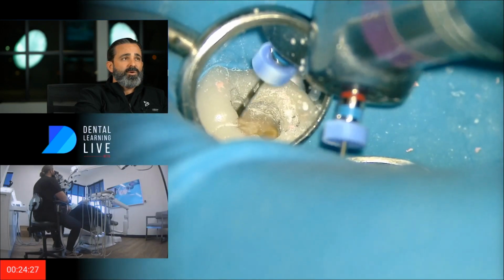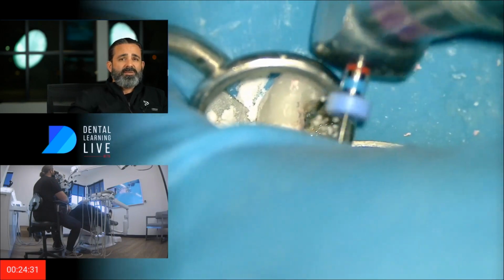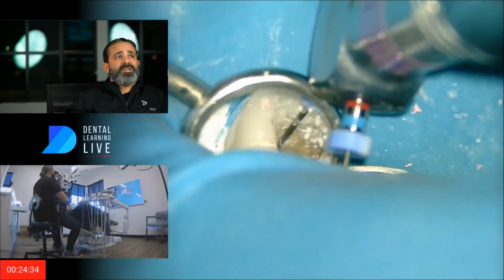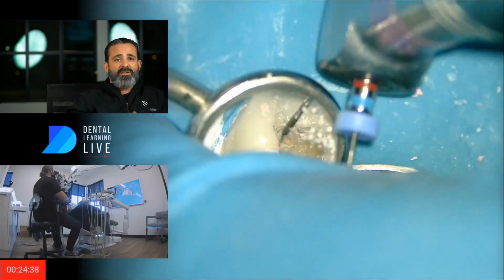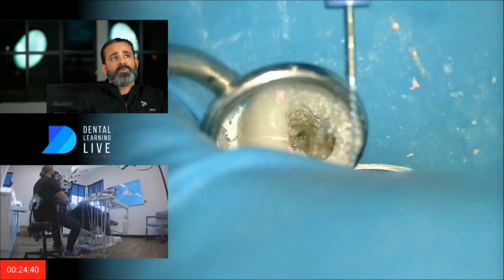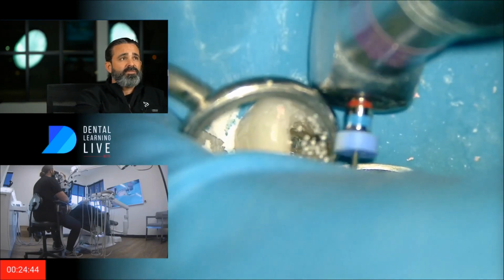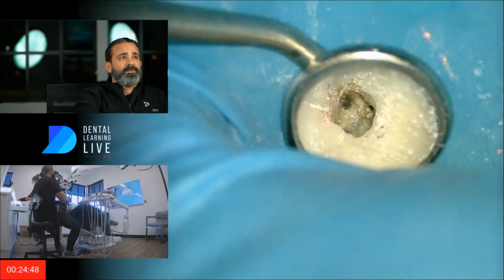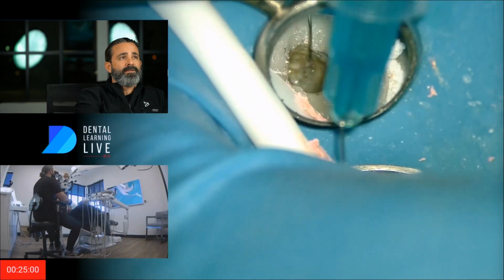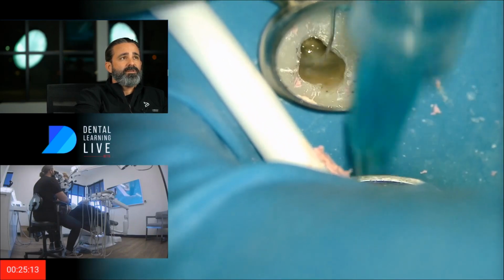And then just going around one final time since I put solvent everywhere, I'm just seeing, sometimes I think I'm clean. And I'll do this technique at the very end with this 3D shaper and more solvent. And sure enough, I'll be pulling up more sealer and I'll be pulling up gutta percha even when I don't acknowledge that it's there. And you can always do a check film.